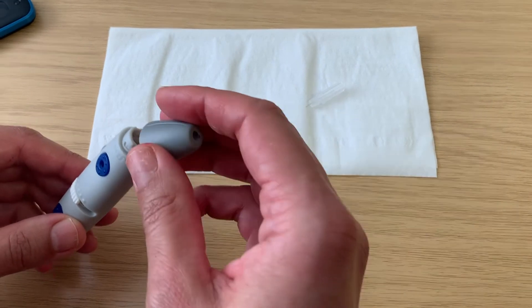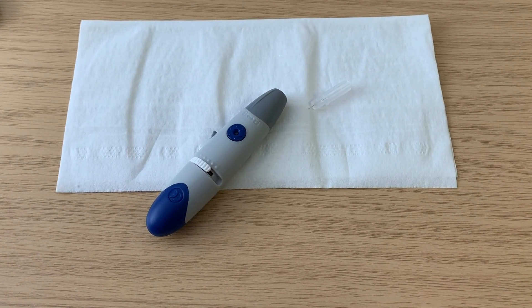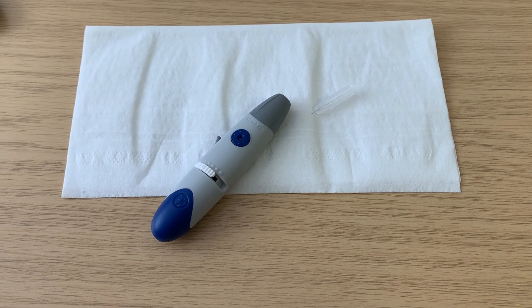It is important to replace the needle in the lancing device once a day, and to use a new blood glucose strip every time you take a blood glucose measurement.